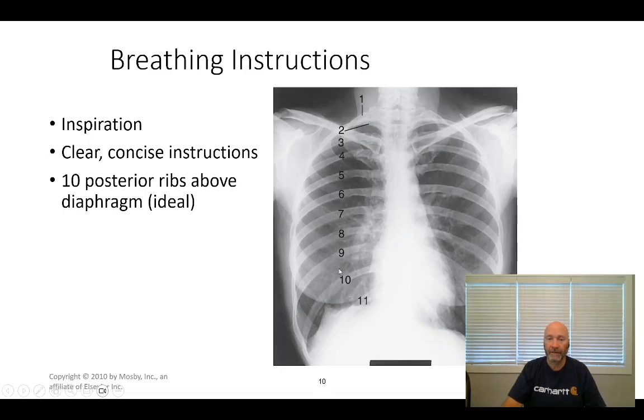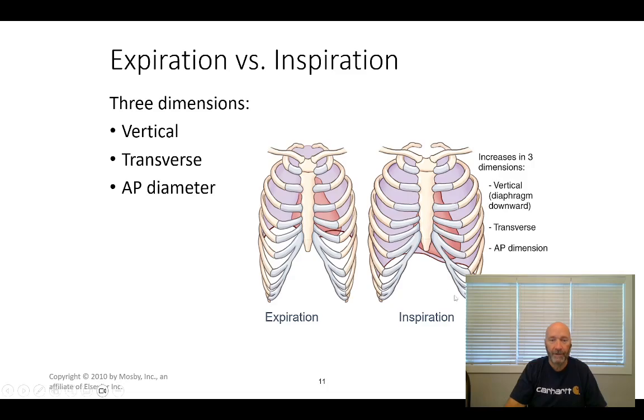We're also going to look at top to bottom, left to right, and we're going to talk about some other things that we need to look at too that just are not reflected in Bontrager's or the Merrill's. So this just shows us what our respiratory excursion is and kind of describes what happens whenever the patient breathes.